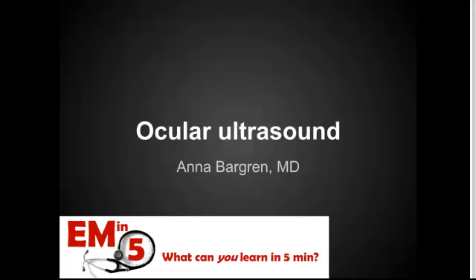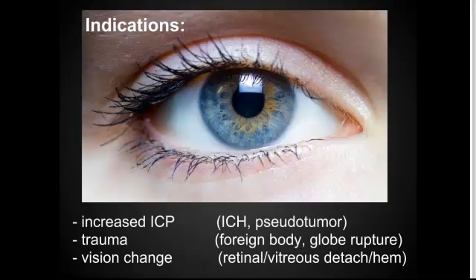I wanted to talk about ocular ultrasound. And there are a lot of great talks out there on ocular ultrasound. Hopefully I can point you in the right direction to a few and cover some of the basics today here.